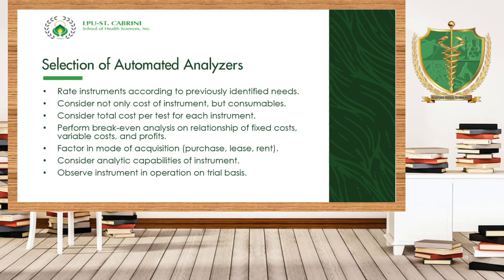distributors ng machine pero yung machine pinagagamit nila sa mga innovation. Siyempre, yung mga reagent, yung machine wala kang bayad. After 1 year, at efficient, maganda ang result ng machine, then saka mo siya balik-balik. You have to consider that.